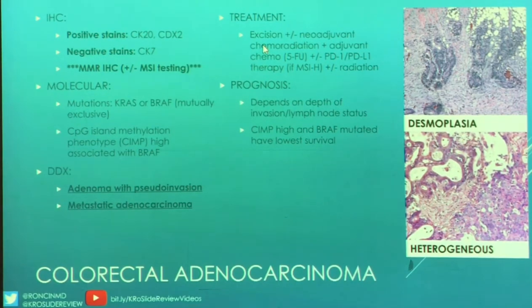The presence of tumor deposits and satellite nodules, those are reportable in your synoptic report and stuff like that, and they affect prognosis. Tumor budding is not one of those things.